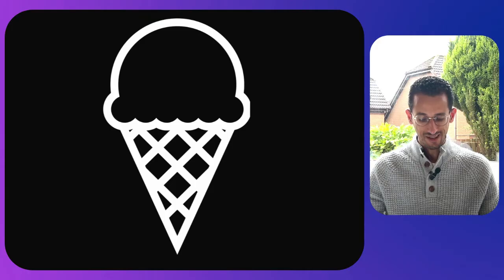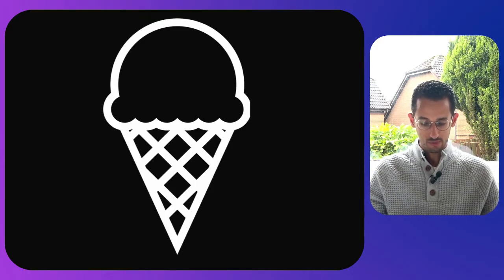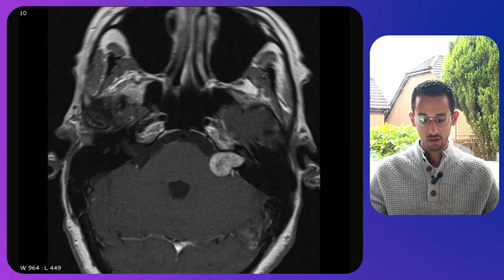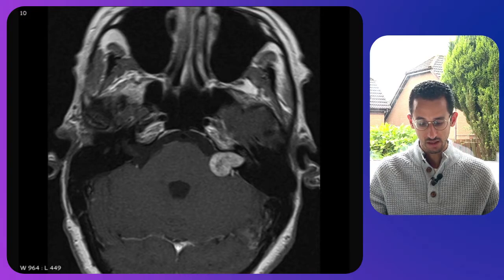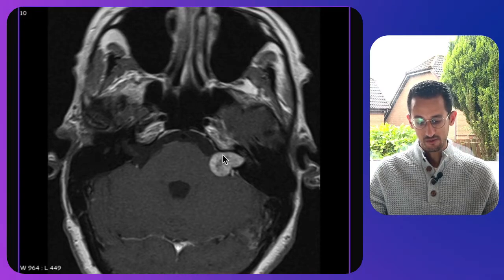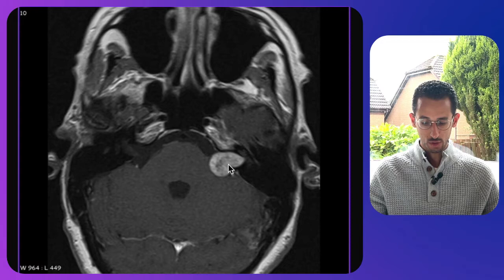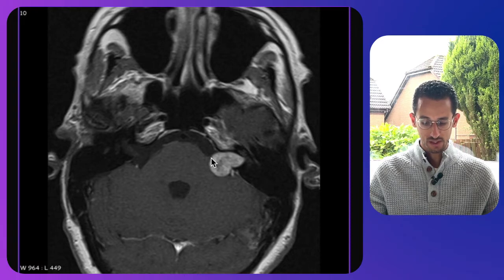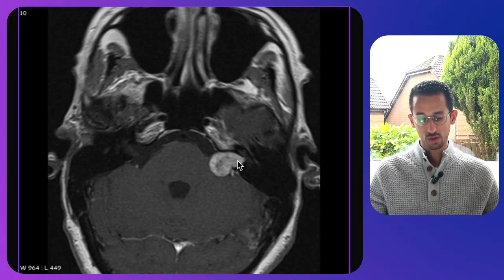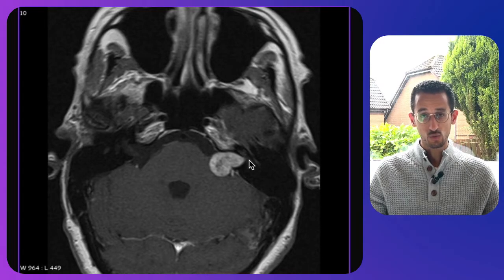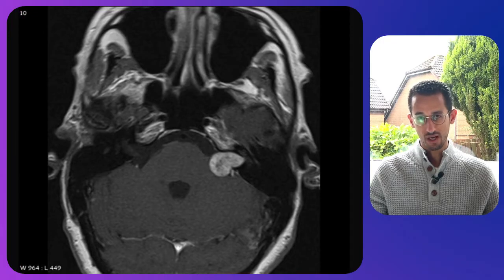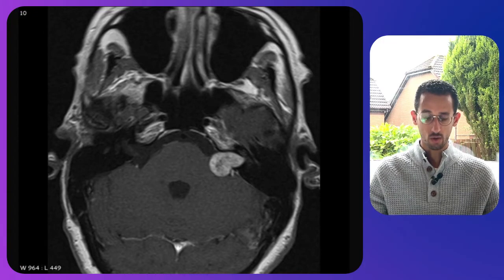We'll start with the first one which looks like an ice cream cone. Looking at this MRI scan, you can see there is a lesion here around this area. This is a vestibular schwannoma and it looks like an ice cream cone because of this part of the tumor which extends towards the brain stem and towards the cerebellopontine angle, while the base of the cone correlates with the intracanalicular part of the tumor. This ice cream cone appearance is characteristic for vestibular schwannoma or acoustic neuroma.